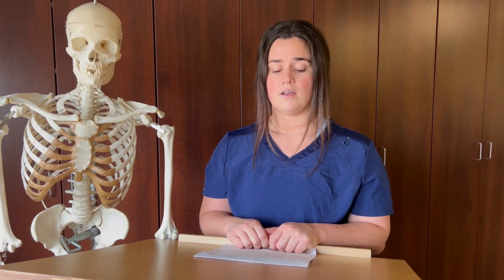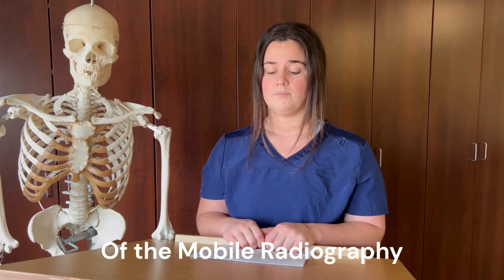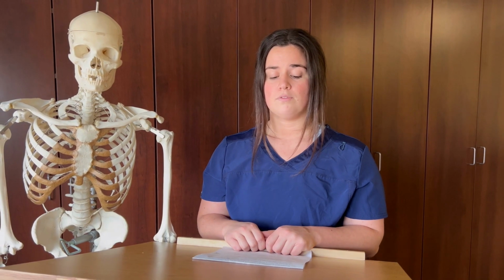It is also important to ensure that you have at least 6 feet of distance between you and the X-ray source, as well as removing other people from the room to eliminate unnecessary exposure to both the technologists and other patients. We also demonstrated and explained using lead shields, especially during fluoro procedures, to protect sensitive organs from radiation. It is important to properly adjust exposure time based on the patient's age and size. It is especially important to reduce exposure time for pediatric patients to protect their developing organs.